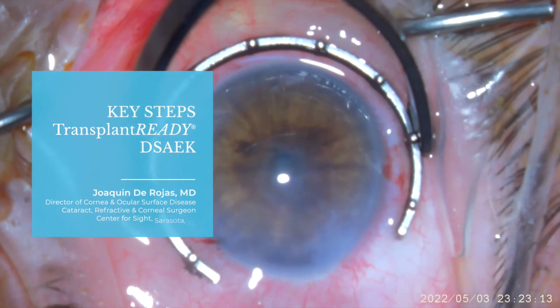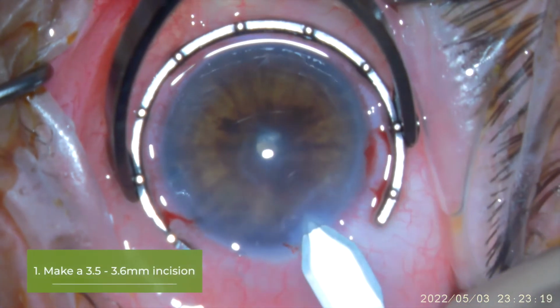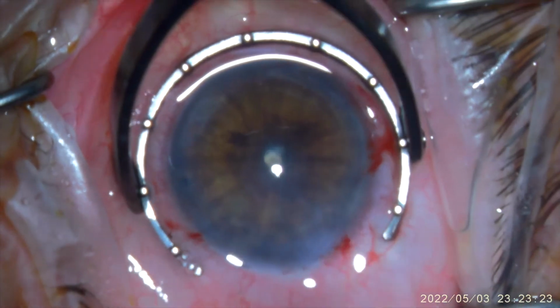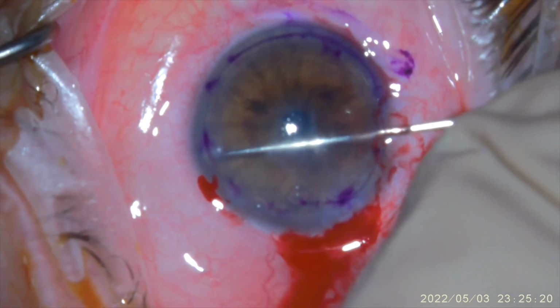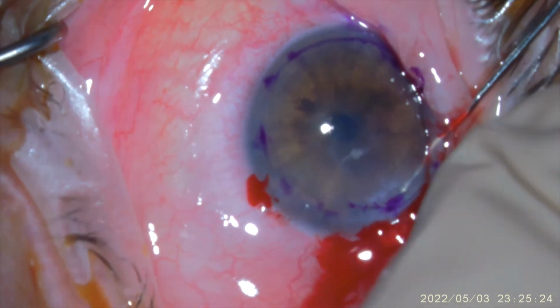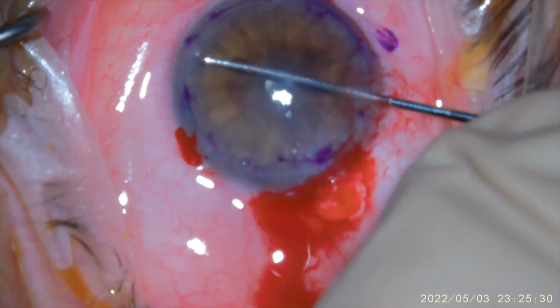I'm now using a 3.2 millimeter blade to open up the old cataract incision and slightly enlarge it to about 3.5 to 3.6 millimeters. I go across the eye and I score Descemet's membrane. I start left first, then I go back to the origin and I go towards the right, following my marks.